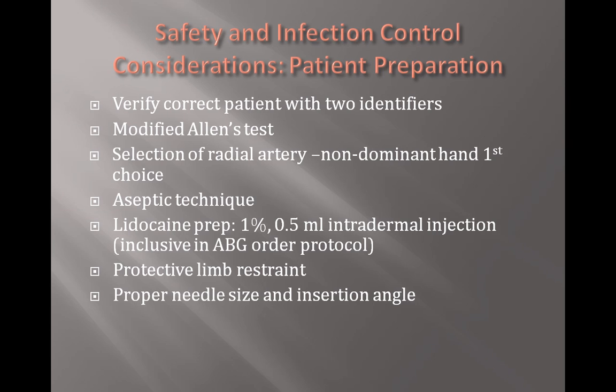If you've observed this with other clinicians, it's not an acceptable technique, as it's unlikely that you're going to be able to get the entire bevel of the needle in the artery, allowing for adequate blood return and successful puncture. But rather, you're more likely to hit the posterior aspect of the vessel and actually go right through the vessel, getting a flash of blood and an inadequate blood return. And you're just placing your patient at risk for vessel injury and excessive bleeding.